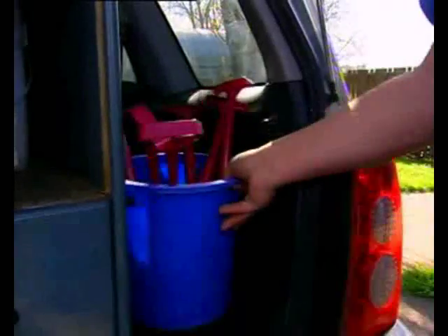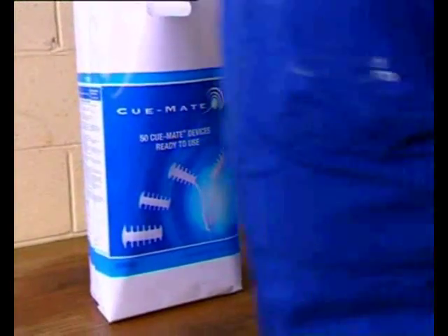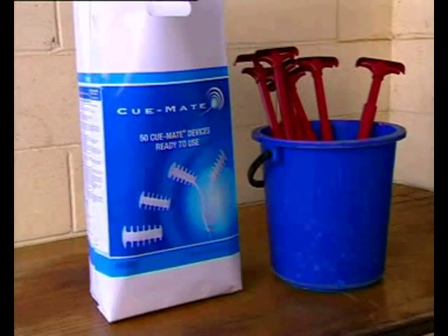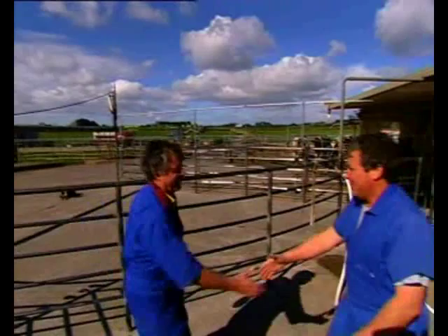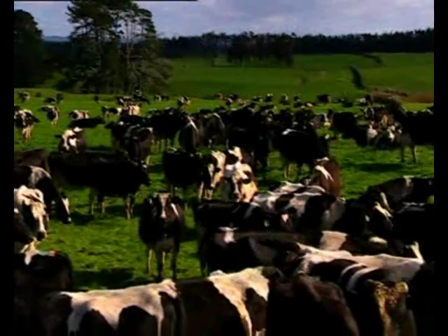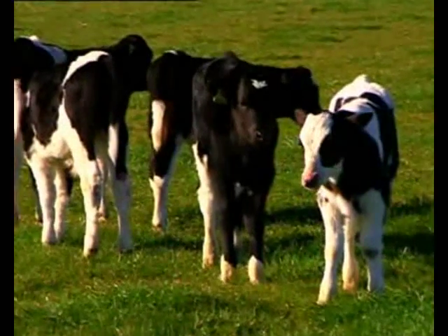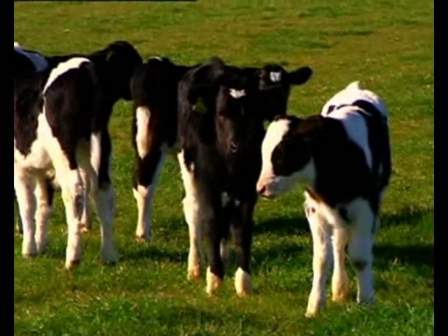We intend to demonstrate the procedures for the use of Q-mate. Reproductive programs should be implemented in close consultation between a veterinarian and the farmer. The main purpose of Q-mate treatment is to get cows in calf on time, as delayed calving results in lost days in milk.